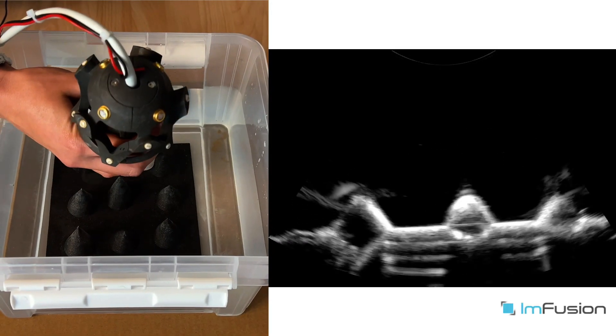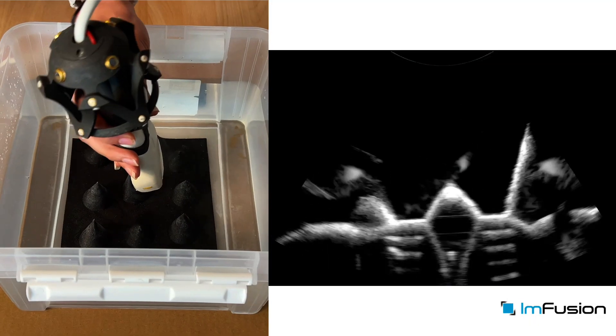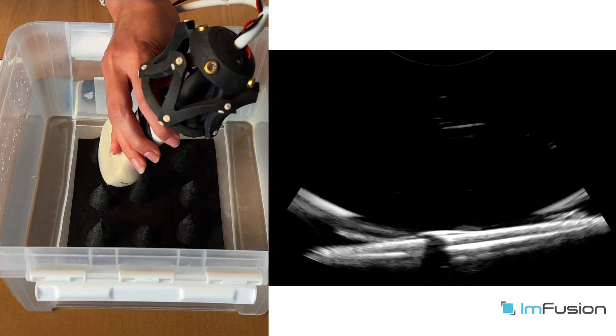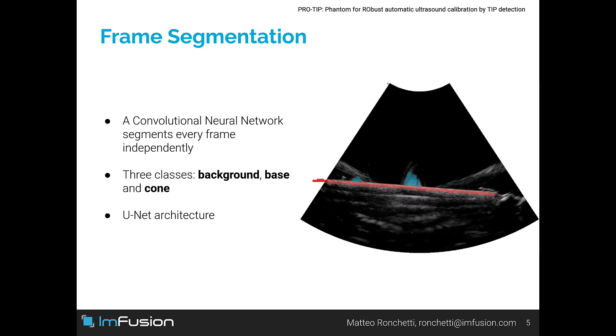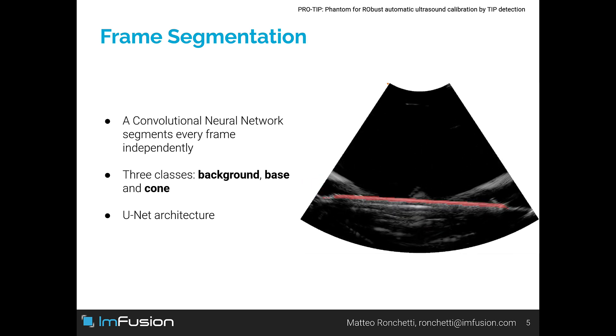The first step of our calibration method requires the user to acquire two sweeps with orthogonal motion, as shown in the video. We segment every frame of the sweeps using a convolutional neural network, distinguishing between background, the base of the phantom, and the cones.